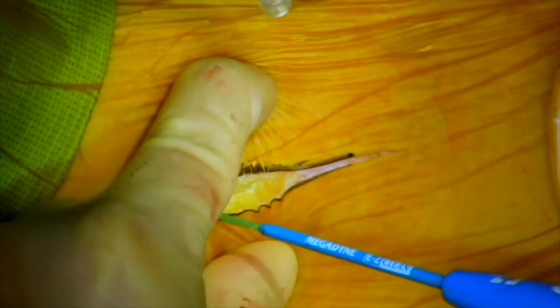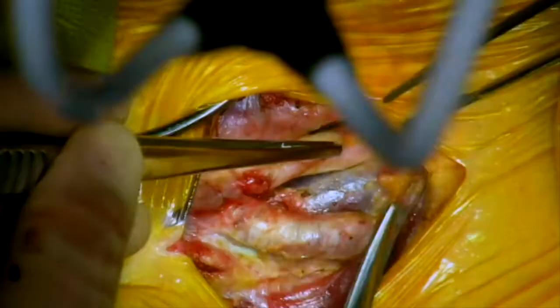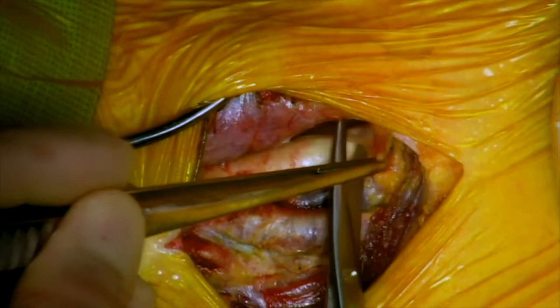A supraclavicular incision is made medial to the sternocleidomastoid muscle, which is taken down through the platysma down to the common carotid artery. The artery was circumferentially dissected. In view, the patent ringed carotid subclavian bypass graft is presented.